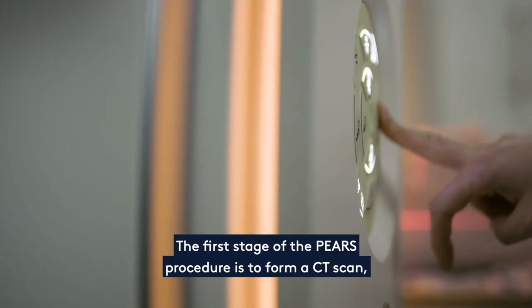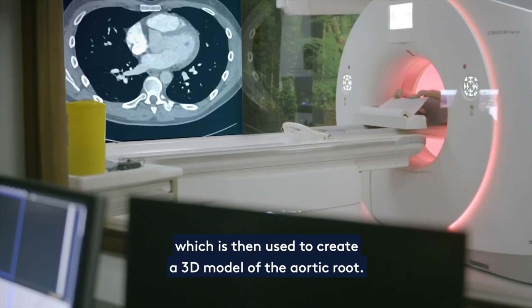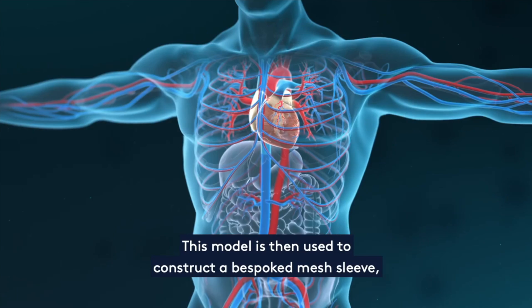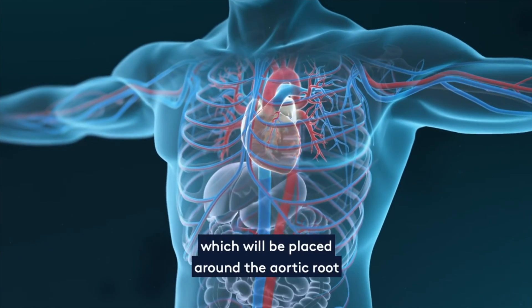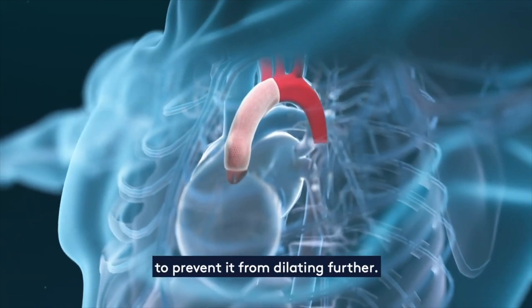The first stage of the PEARS procedure is to perform a CT scan, which is then used to create a 3D model of the aortic root. This model is then used to construct a bespoke mesh sleeve, which will be placed around the aortic root to prevent it from dilating further.